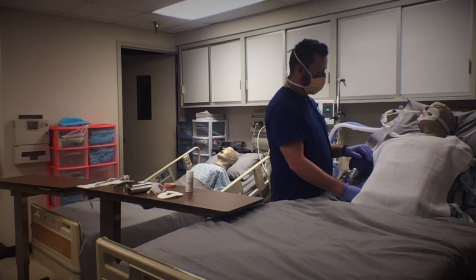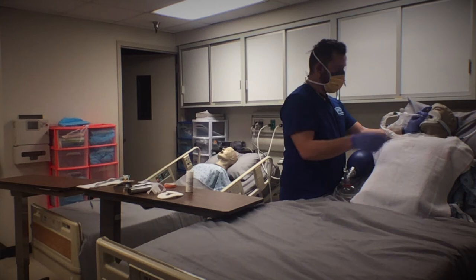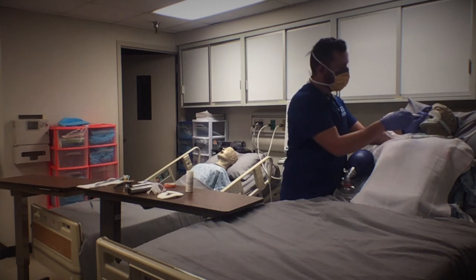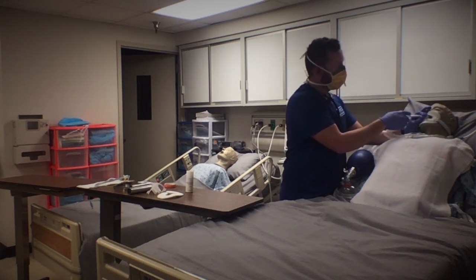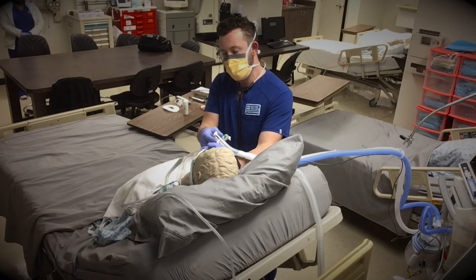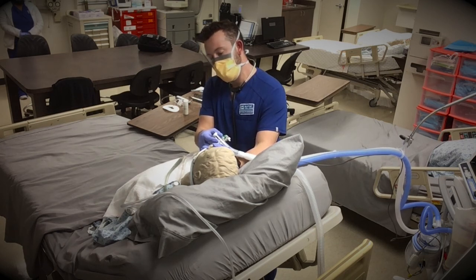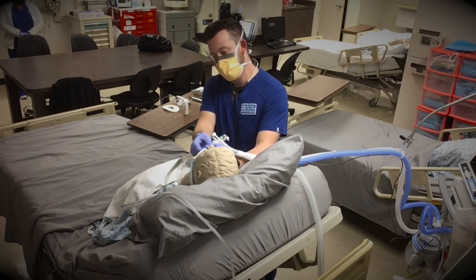Mr. Daniel told me that he was ready. So right now, I'm just removing the tape that's holding the tube in place. Alright, Mr. Daniel, I'm about to pull that tube. Make sure I have my Yankauer in place. Alright, on the count of 3, I'm going to pull the tube, Mr. Daniel. I'm going to need you to give me a big cough. Ready? 1, 2, 3.